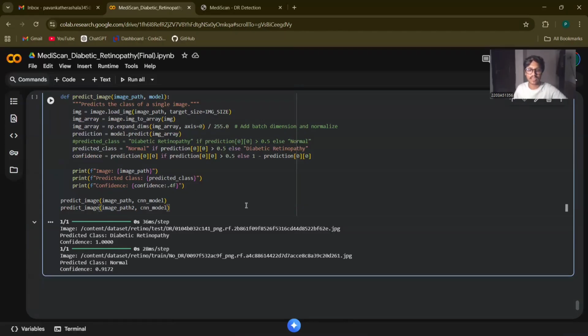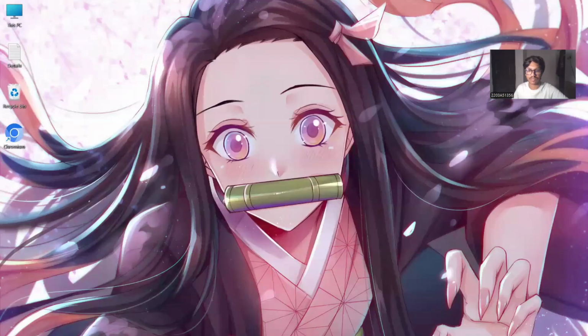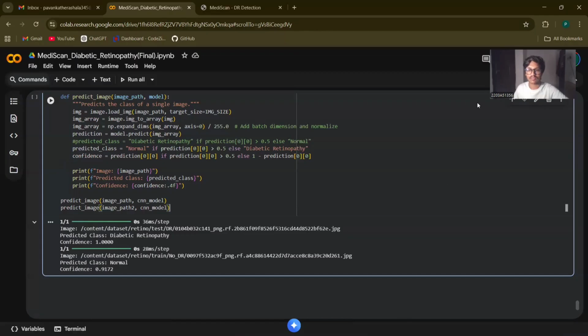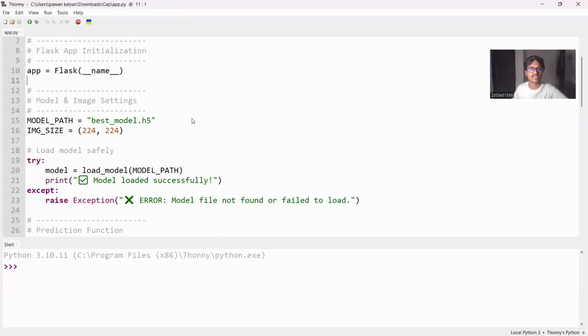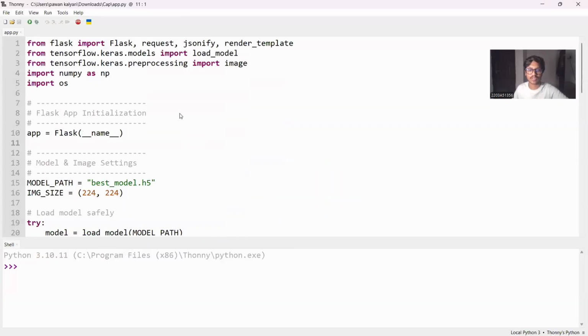And after this, to turn it into a front-end, we did the front-end format for this. This is our front-end code. This Python script creates a simple web application using the Flask framework, allowing a user to upload an image of a retina via a web browser. This app's core function is to load a pre-trained deep learning model, a CNN, which we saved as best_model.h5, which acts as an AI diagnostic tool.